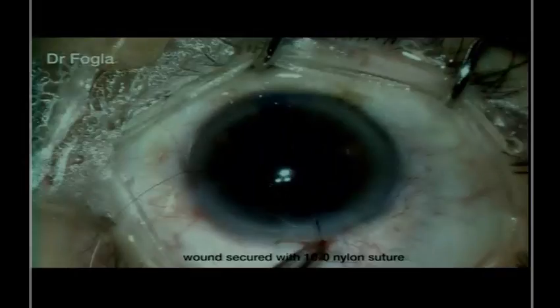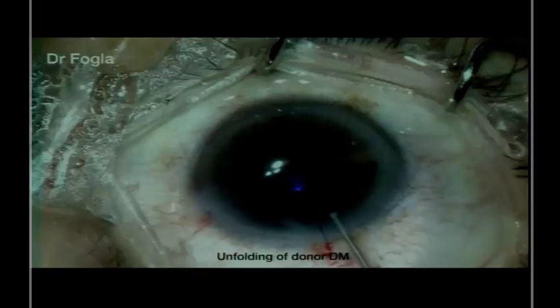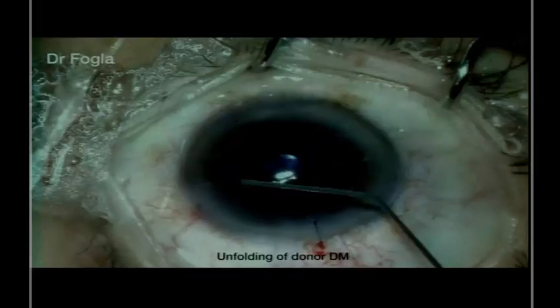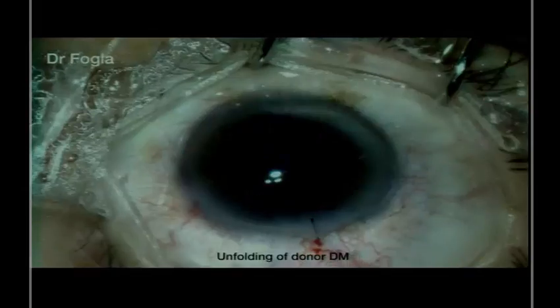I always prefer to suture my wound. Again, you can see that as you shallow the chamber, the one edge of the roll tends to open up, and then you can use two cannula or a single cannula maneuver. The partially opened part, you can stabilize it with one cannula and use the other one like a drum roll to open up.